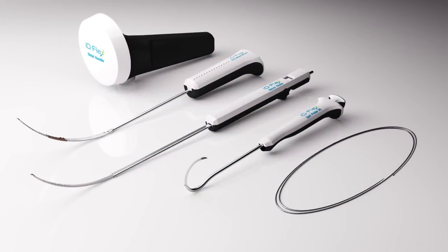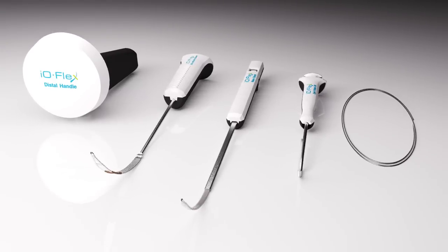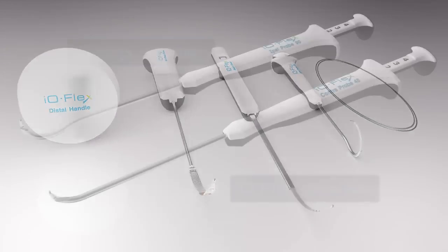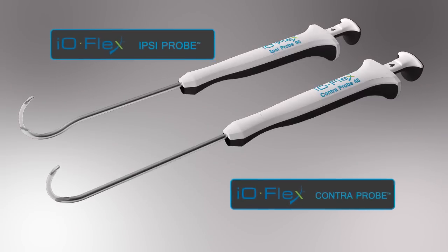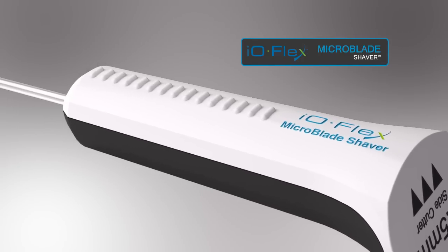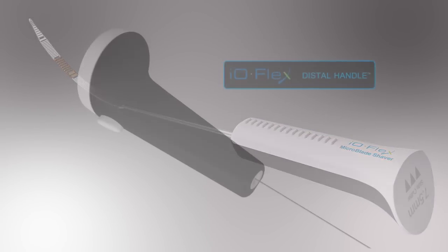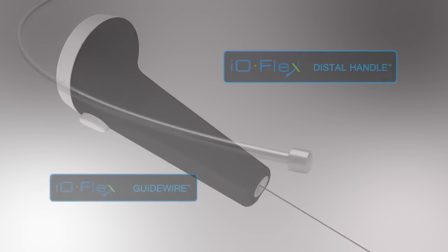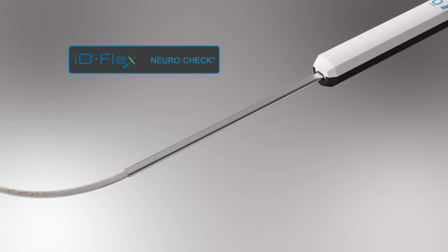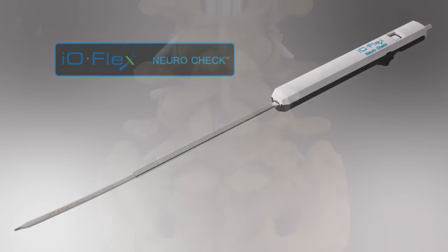Now there's an innovative solution with the Baxano IOFlex system, an advancement in surgical technology for foraminal, lateral recess, and central lumbar stenosis. The IOFlex system uses thin, flexible instruments to provide precision decompression from the inside out. This over-the-wire approach offers physicians a direct decompression system that aims to preserve facet joint integrity while helping to minimize muscle trauma without an implant.